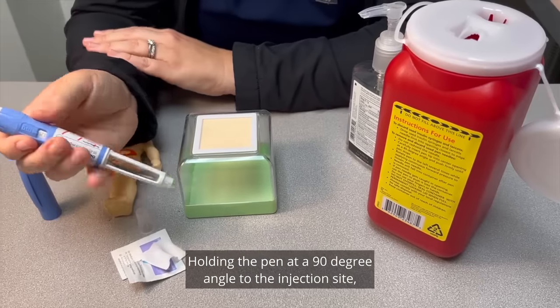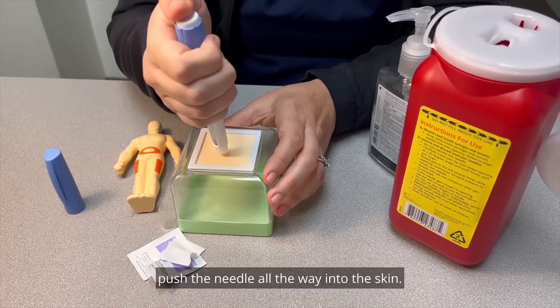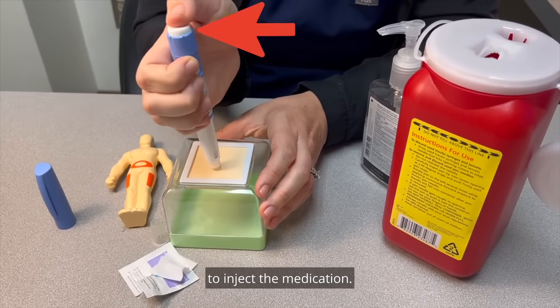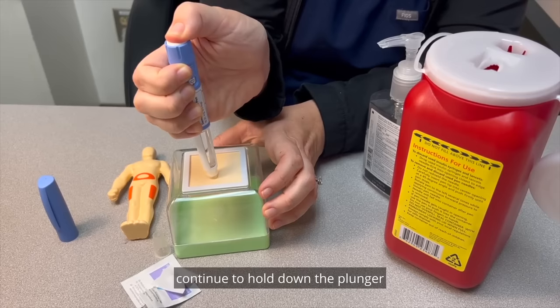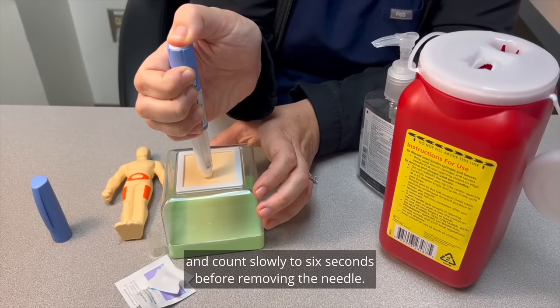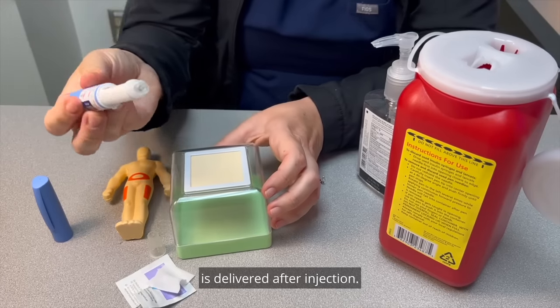Holding the pen at a 90-degree angle to the injection site, push the needle all the way into the skin. Press the plunger at the end of the pen to inject the medication. When the dose dial turns to zero, continue to hold down the plunger and count slowly to six seconds before removing the needle. This ensures all the medication is delivered after injection.